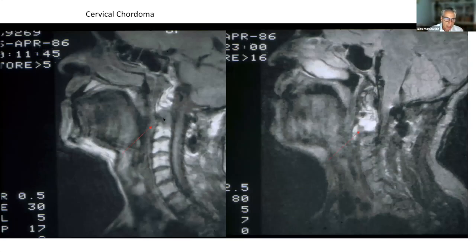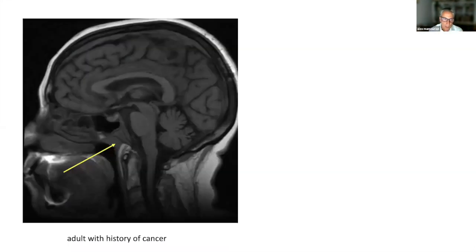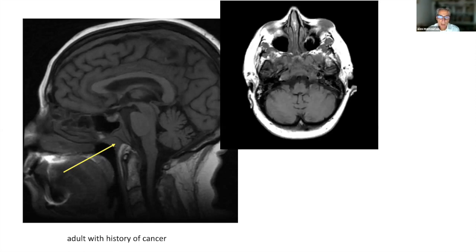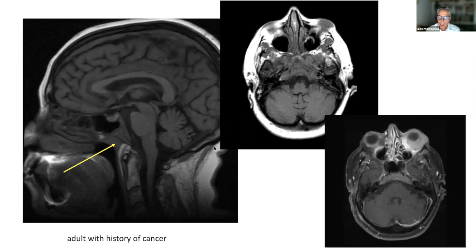Chordomas can also occur in the spine — this one is in the cervical spine, again with long T2 time and high signal intensity on the T2-weighted scan. This is a different entity: here we have loss of bone marrow in the clivus with some soft tissue present. Whenever you see this pattern of involvement in the clivus, with or without bony destructive change, you want to consider metastatic disease. This turned out to be a clival metastasis, although it could also represent extension from a nasopharyngeal cancer in the appropriate clinical circumstance.